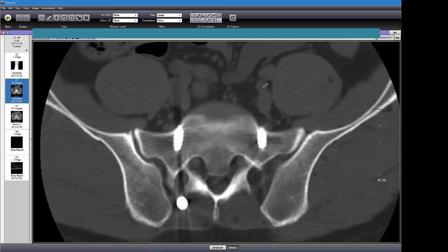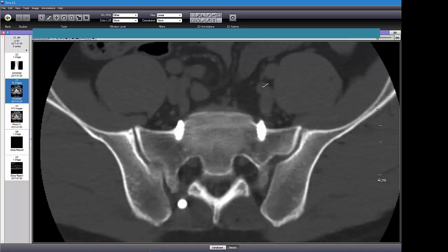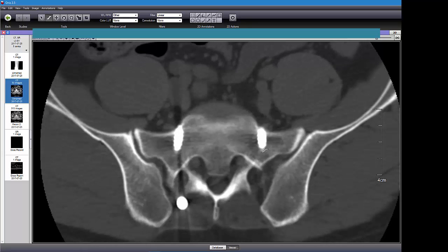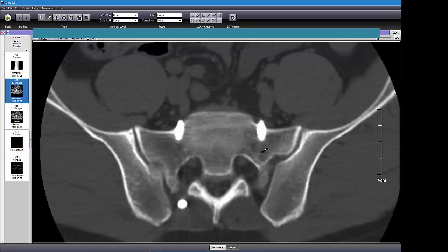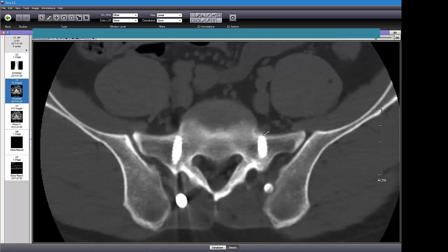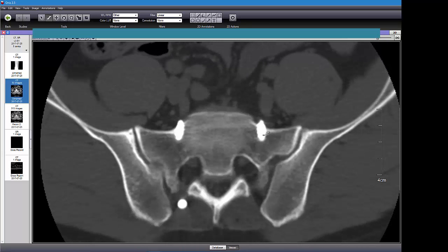Okay, so we're going up. Let's see when we come to the L5 disc space. So here's the bottom set of pedicle screws through the ala of the sacrum. Okay, let's see how they do. You see how we can see how the screws go? So not too shabby. They just extended too far here, too close to blood vessels for my liking. I can live with that though. Well, I don't know. Let's go up.